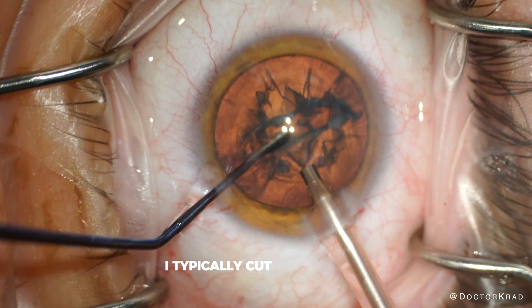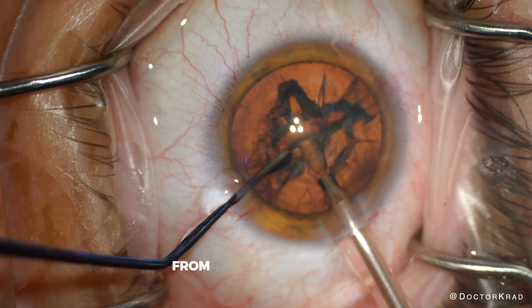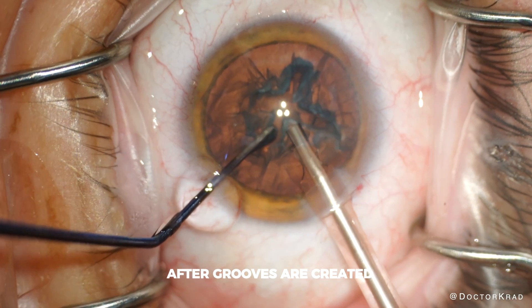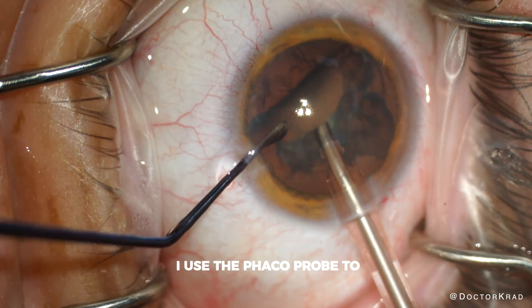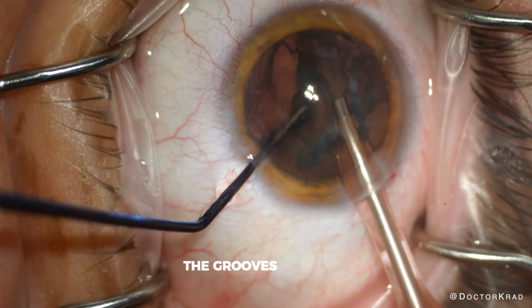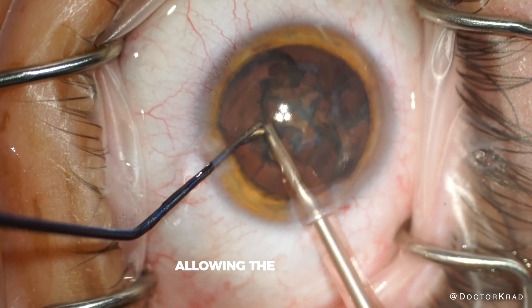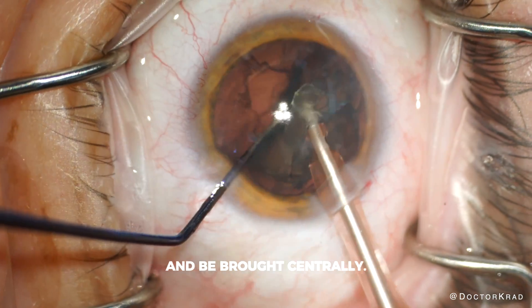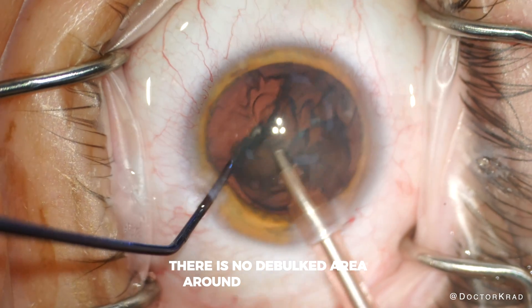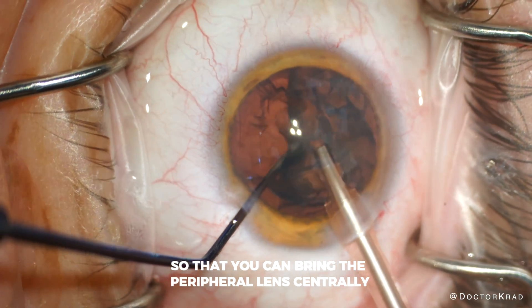I typically cut my sculpting energy in half — for example, down to 30 torsional from a typical 60 or 70 for a cataract. After grooves are created, I use the phaco probe to aspirate the peripheral lens centrally. And as you see, the grooves act like a crease, serving as a point of flexion, allowing the peripheral lens to fold and be brought centrally. Without grooves, there is no debulked area around which the lens can fold or flex so that you can bring the peripheral lens centrally.